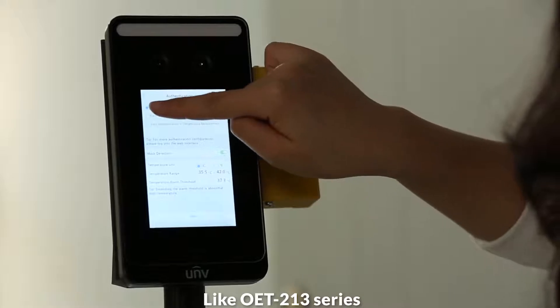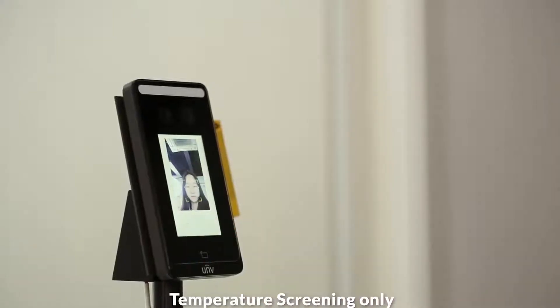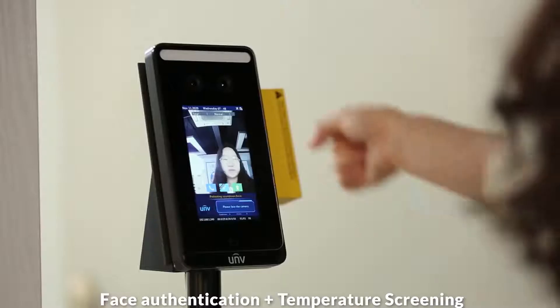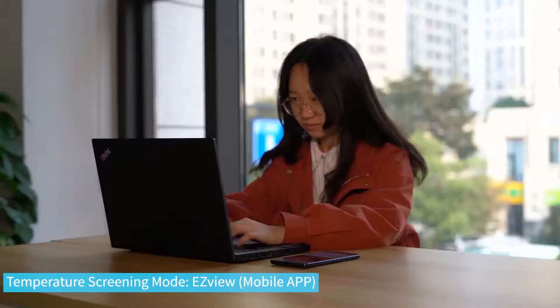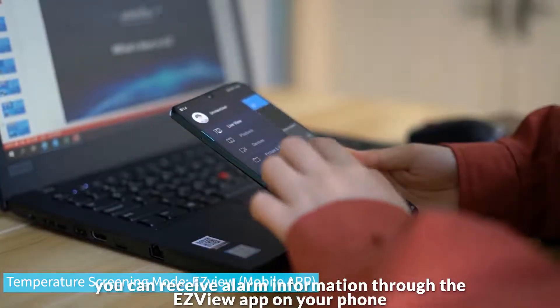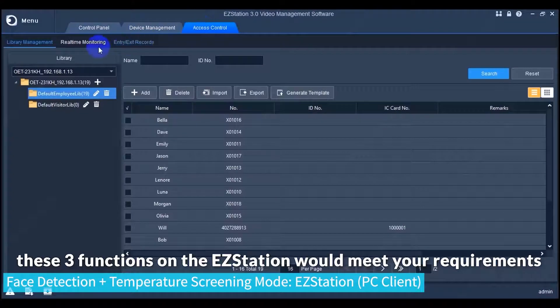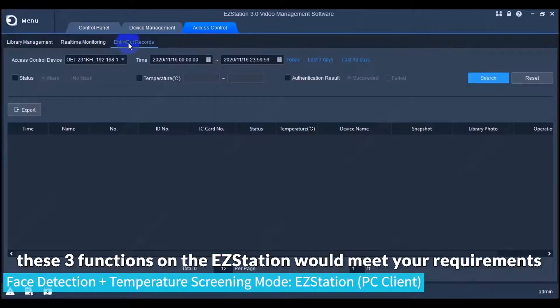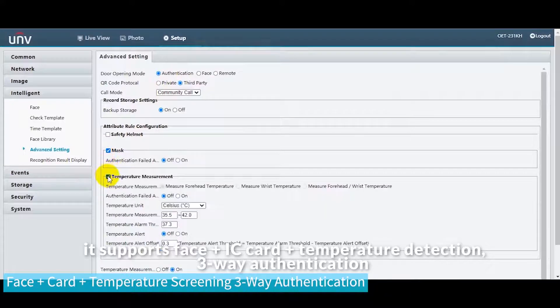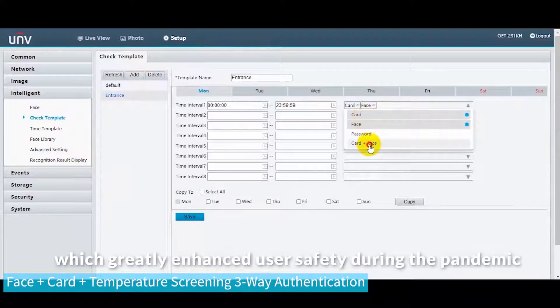Like the OET-213 series, the OET-201 series has three typical application modes: Temperature Screening only, Face Detection plus Temperature Screening, and Face Authentication plus Temperature Screening. In Temperature Screening mode, you can receive alarm information through the EasyView app on your phone. In Face Detection plus Temperature Screening mode, three functions on the EasyStation would meet your requirements. In terms of access control, it supports Face plus IC card plus Temperature Detection three-way authentication, which greatly enhances user safety during the pandemic.